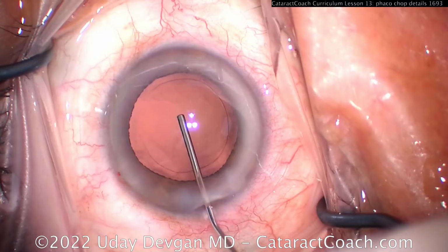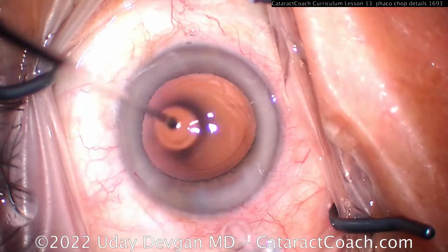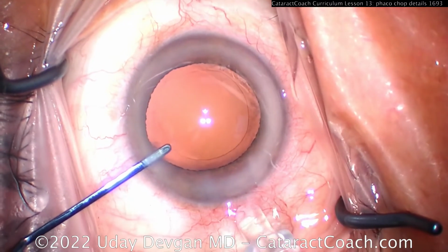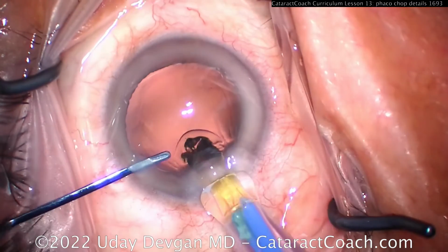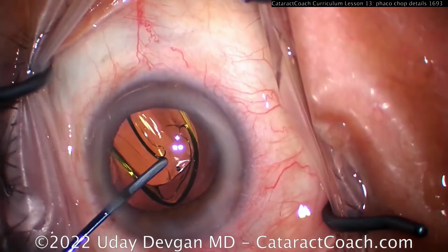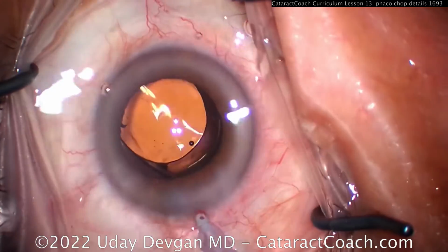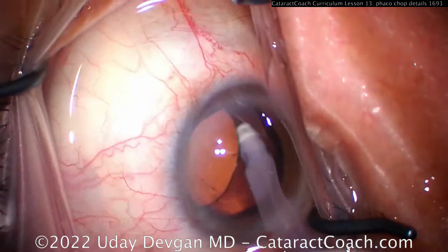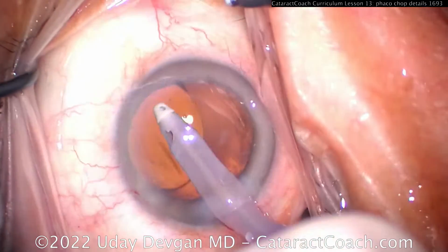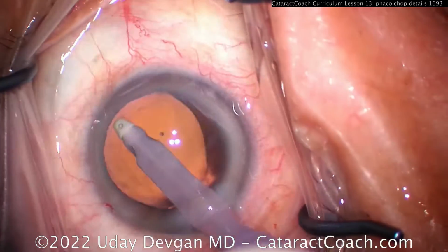Now put the lens in the eye. At the end of the case, what do you want to do? You want to wash out all the viscoelastic. So think about it. What do you want to change your settings? Yeah, of course you want high vacuum. But to wash things out, you want flow, high flow. So I'll do a flow here at the end of 60 cc's per minute. And that high flow rate will help wash out the viscoelastic. Of course, keep the vacuum level high as well. That's very important because you want to vacuum out all the viscoelastic that's remaining there.